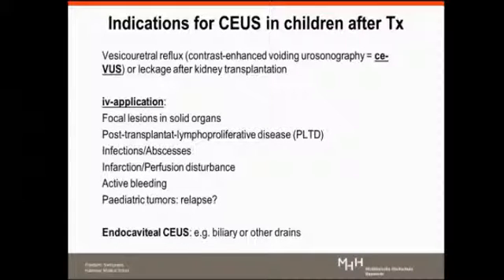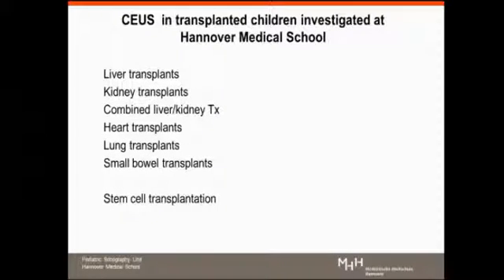But you can also use endocavitary CEUS, for example, putting a little drop of contrast and then giving it in biliary or other drains to see, for example, abscesses or the biliary system. So at Hannover Medical School, we investigated children after liver, kidney, or combined liver-kidney transplants, after heart transplant, lung, small bowel, and stem cell transplantation.